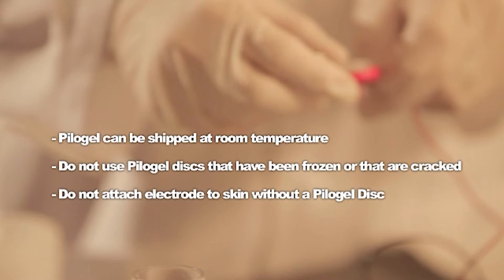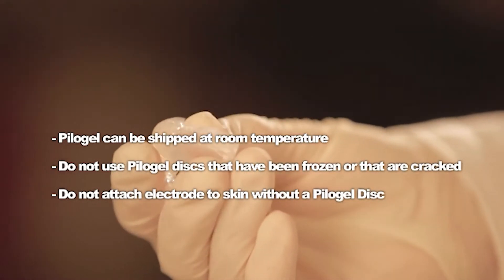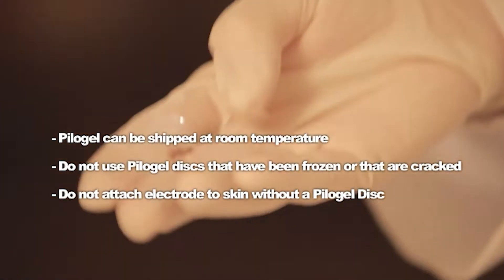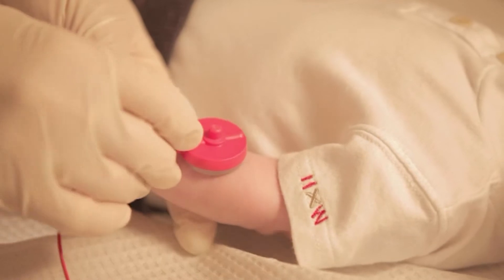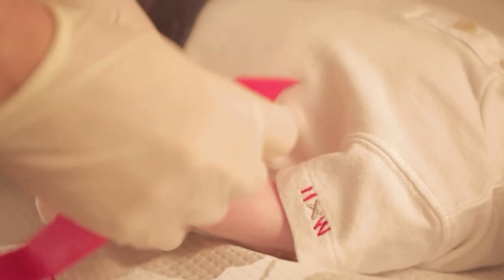Pilot gel discs may be shipped at room temperature. Do not use pilot gel discs that have been frozen or that are cracked. Discs that have been frozen will crack or crumble easily with moderate flexing of the disc. Do not attach an electrode to the skin without a pilot gel disc.